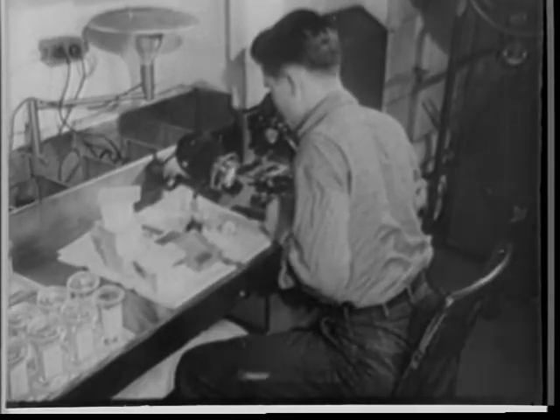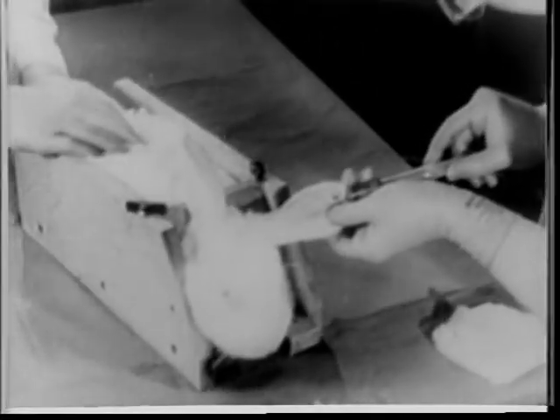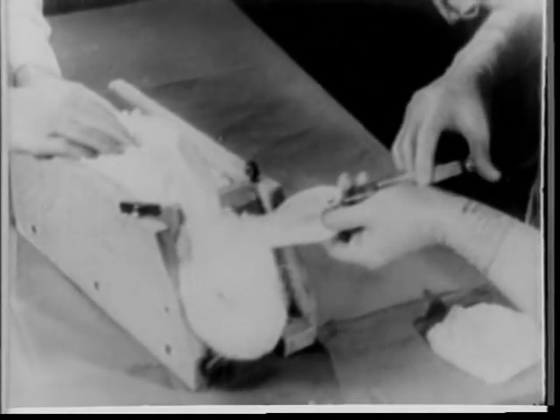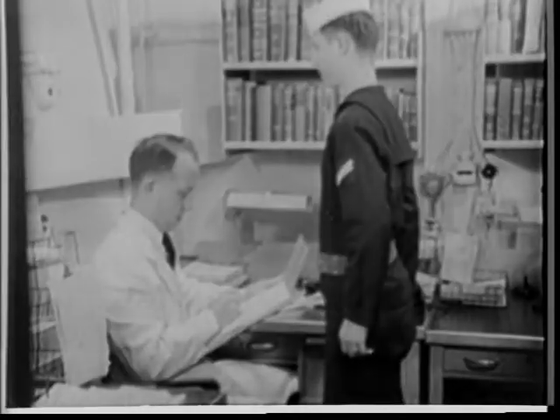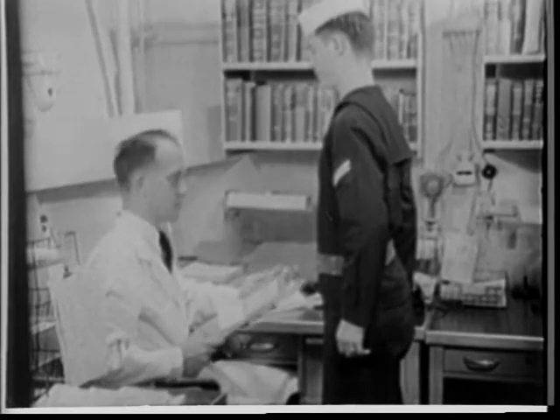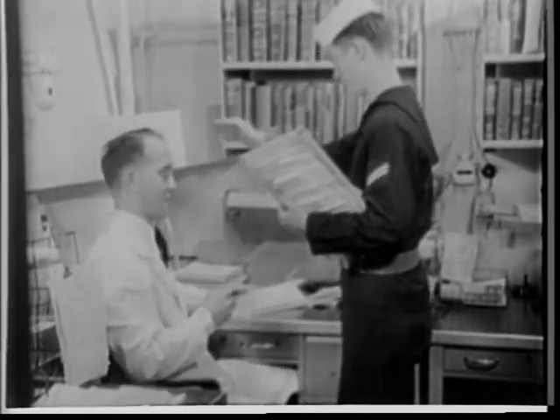They are sent to a laboratory on a hospital ship or to a shore station for analysis. In the laboratory, the samples would be tested. In some cases, it might be necessary to inject laboratory animals to identify the BW agents. The results of the laboratory analysis will be sent back to the ship. Now the doctor is certain of what he is fighting.